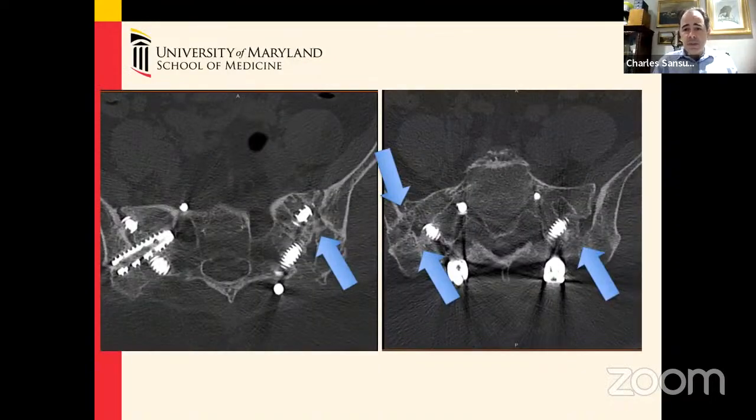Six months later, this CT scan demonstrates evidence of osseous union. You can see bridging bone — here to here, here to here — more bridging bone. There is bridging bone crossing over, roughly six months after the surgery.